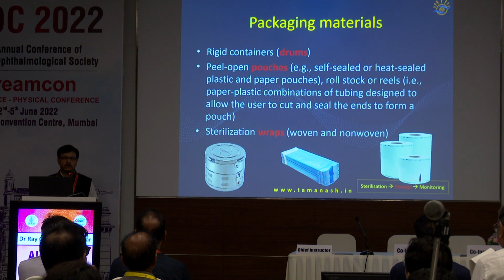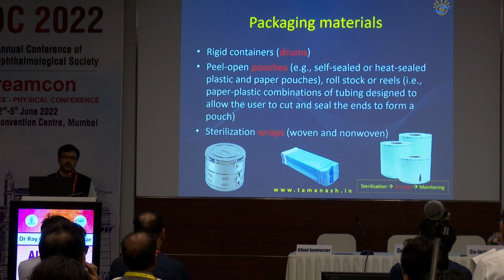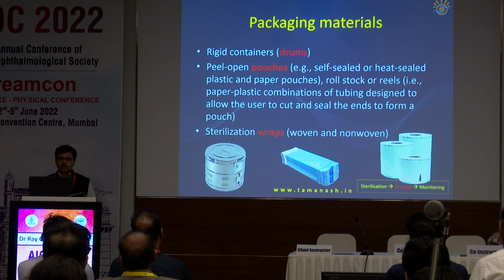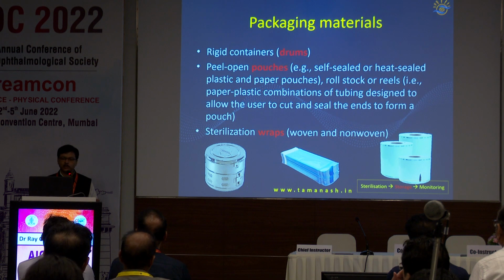that militates against use of drums, because the other two options, which are the plastic wrappers and the paper wrappers, particularly the blue ones that Anshuman showed, are designed in a way that when heat happens to touch them, the pores open, they expand. And as soon as the autoclave cavity cools down, they contract. So it automatically gets sealed. So it is advisable to move on to such woven or unwoven wrappers, or even the plastic devices. But as Anshuman said, you have to be sure that it conforms to the recommendations of the manufacturer, otherwise the plastic may melt.